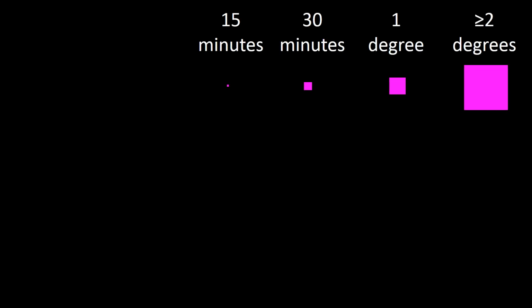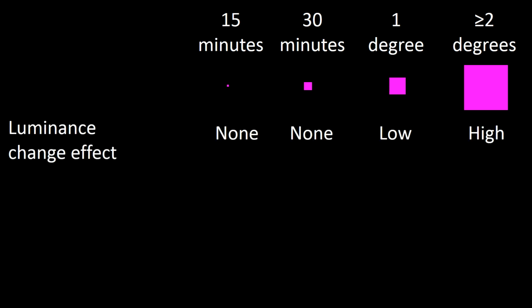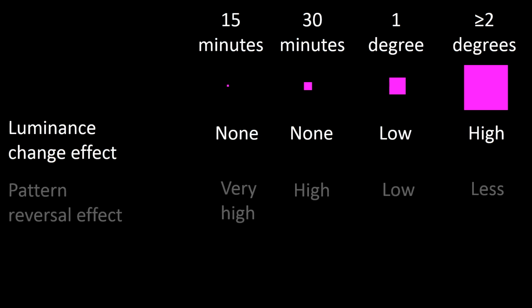The checks or squares can be different sizes, and their size has an impact on luminance. Very small checks do not produce changes in luminance. Larger squares produce changes in luminance, rendering pattern VEP as flash VEP. The manufacturers of the checkerboards have addressed this issue and modern equipment may not be subject to these changes. Another factor related to check size is their impact on pattern reversibility. Smaller squares have higher impact than larger squares in pattern reversibility.